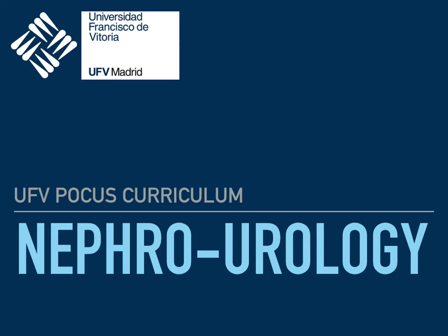Hello everyone, welcome to this video in which we are going to evaluate the usefulness of point-of-care ultrasound for assessing the nephro-urology diseases, mainly affecting the kidney and the bladder.